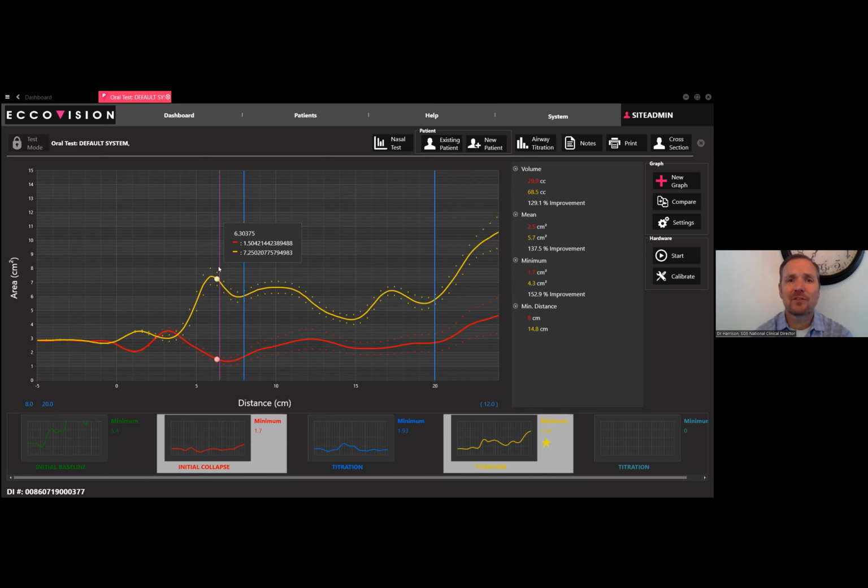And some of these patients, if they're mild, really don't have subjective complaints that might dramatically improve. I was just listening to a sleep physician last week give a talk, and he says, if they're mild, I wouldn't even retest them unless they've gained weight, because it's not going to show you anything. But on a moderate, as we get into an AHI that's over 15, now we need to do whatever we're going to do and retest it. And he was advocating oral appliance for no matter what severity of disease there was, mild, moderate, severe.